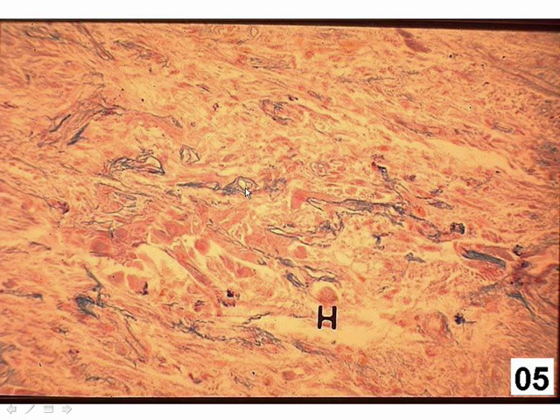And within the axons are accumulations of neurosecretory substance, and they have been given the name herring bodies. That's why they are labeled here with an H. The herring bodies contain, as you will learn in lecture, 2 substances. One is called oxytocin, and the other is called antidiuretic hormone, or vasopressin.